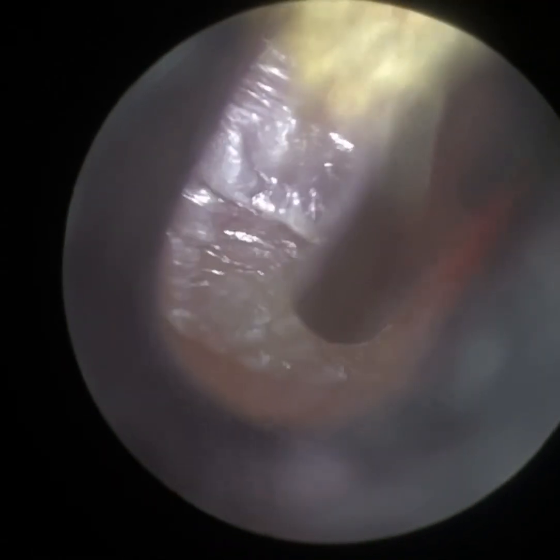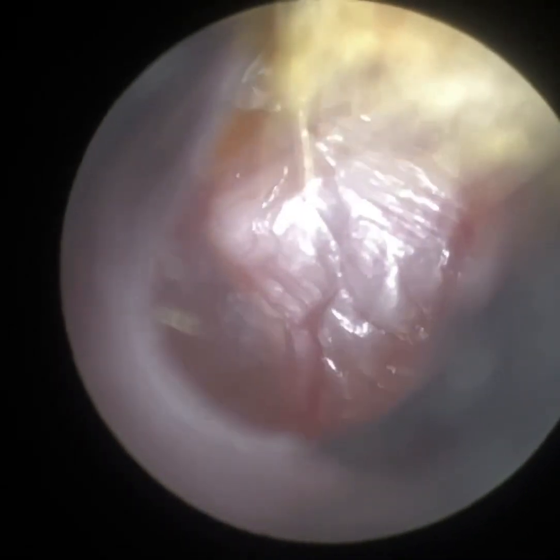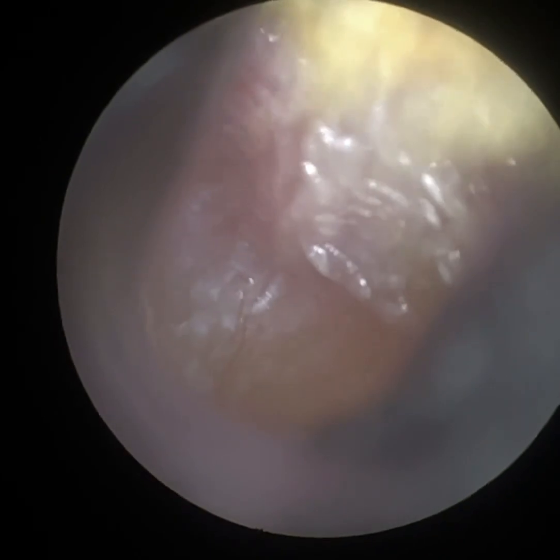Sometimes I just want to do a hover over. You can see there — straight away, that's part of the eardrum, so I'm not going to continue with that. I think that sack was full of fluid, and the fluid is draining away naturally.